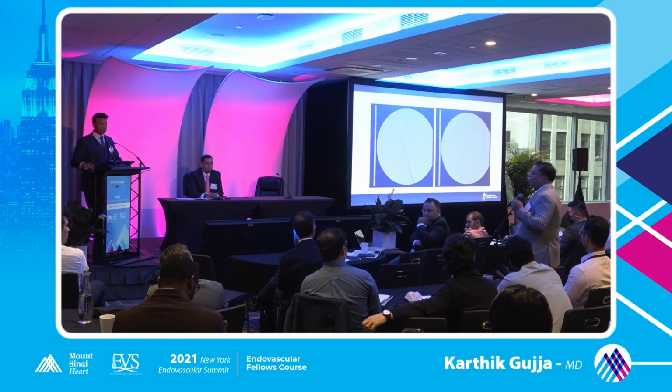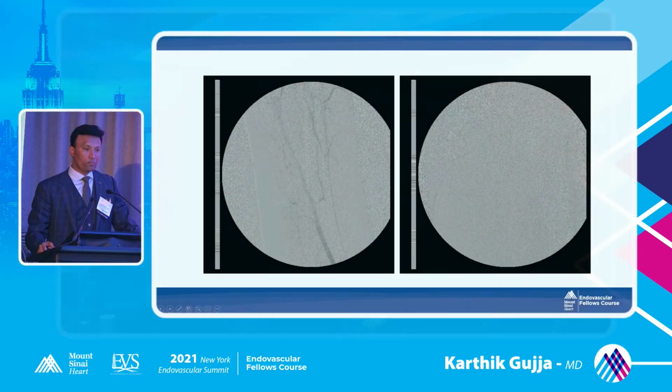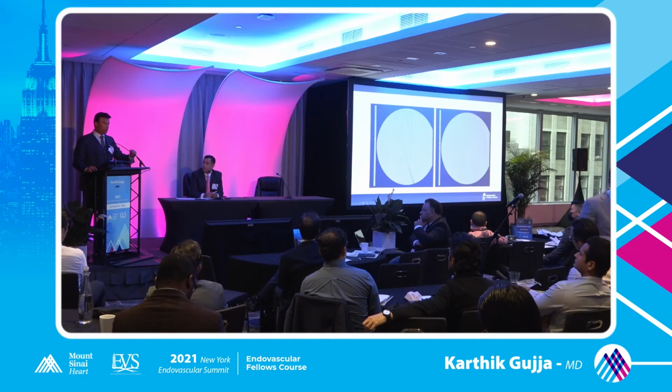Second, could you comment on what filters and how you choose your filter? All right. So there are a couple of filters which are approved.